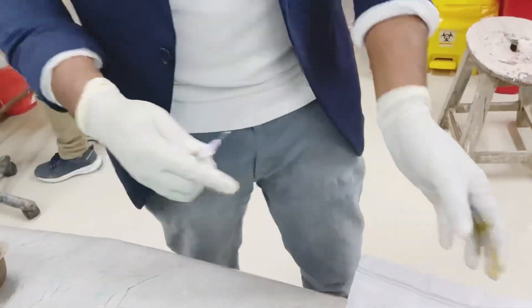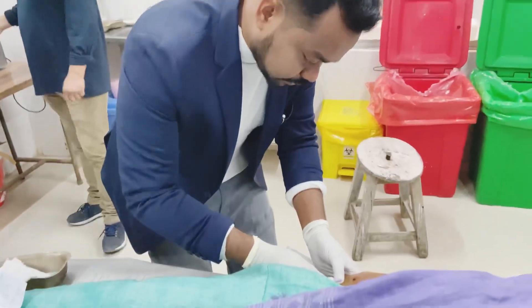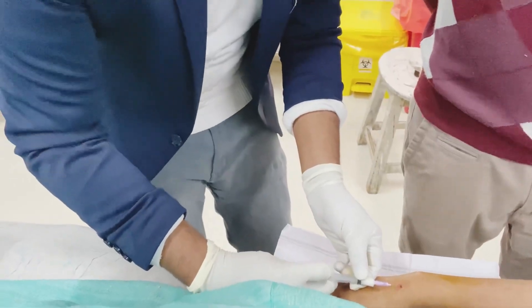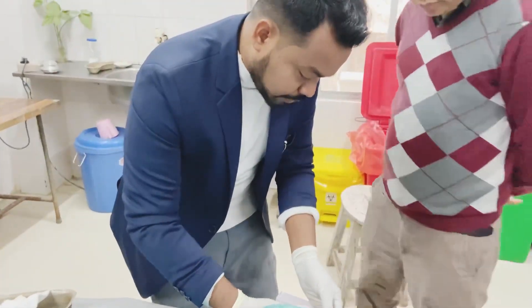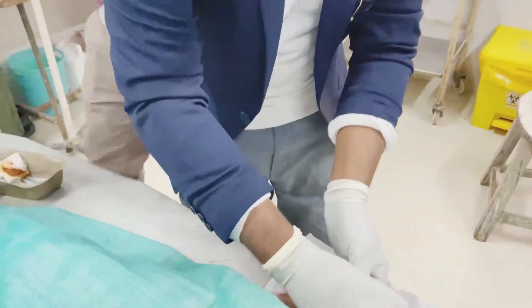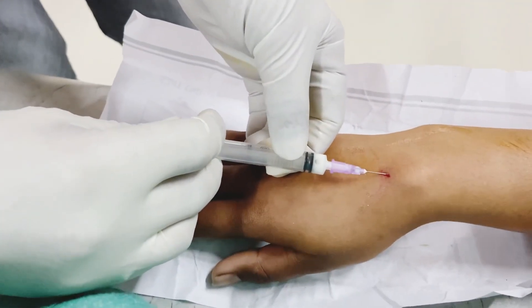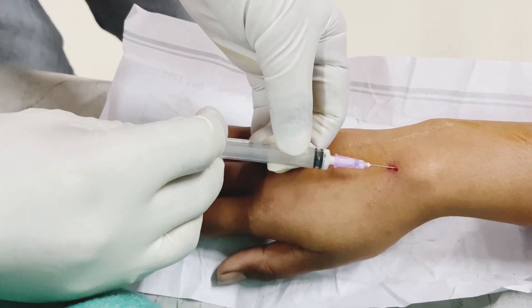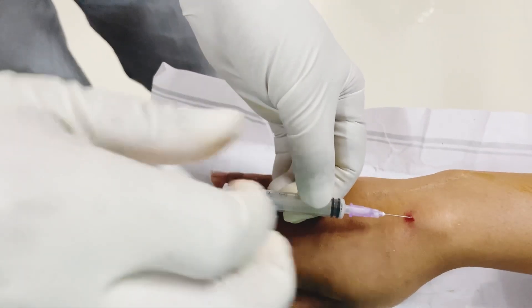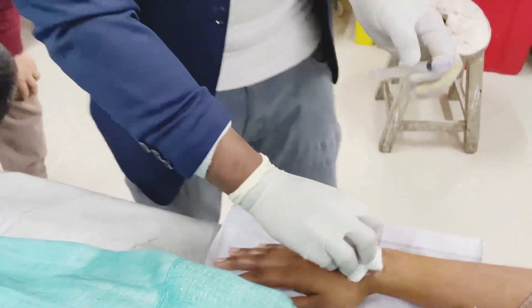Simple aspiration of a ganglion cyst alone has a recurrence rate of 30-40%, but if you aspirate and then inject steroid, it comes down to 10-20%. So I am infiltrating the sac using the same entry point with a smaller size needle. Do simple massage to distribute the medicine.